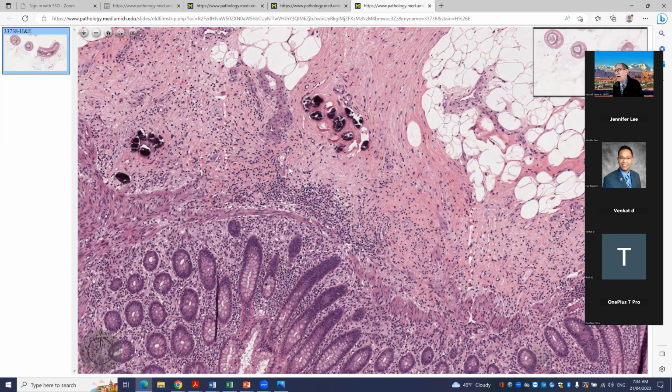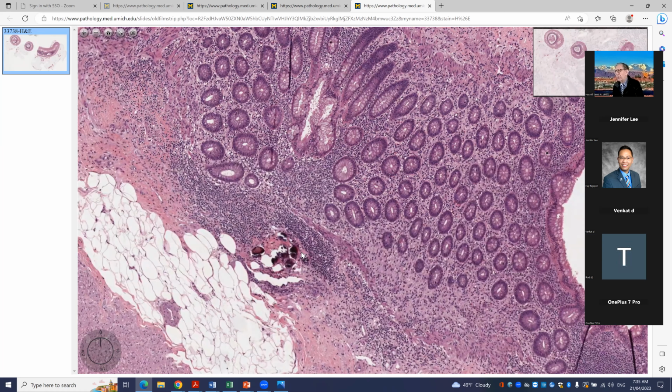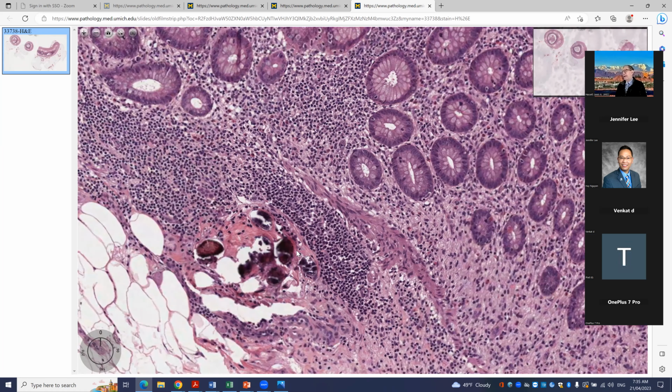Now, as you might imagine, this provokes a little bit of response in terms of fibrosis, but it's actually fairly remarkable that there's not a greater degree of inflammatory response to this. And so you might ask the question, why doesn't the body respond to these more aggressively? What is going on?